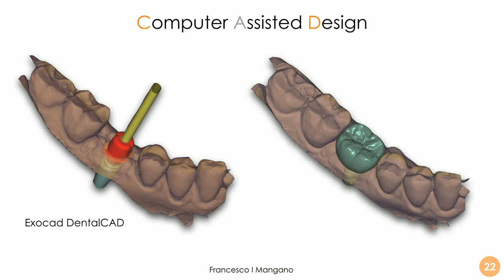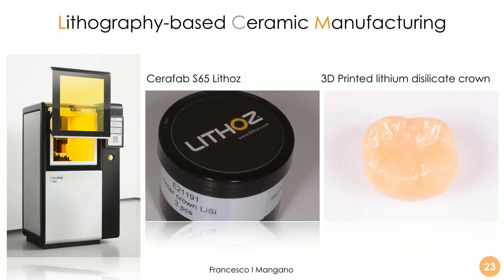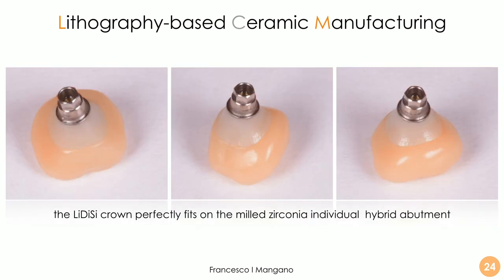The implant position was captured using scan bodies with the CS 3700 intraoral scanner. The dental technician then worked inside exocad software to plan the individual hybrid abutment and the crown. The crown was produced using the CeraFab S65 by Lithoz — specifically in lithium disilicate — as a monolithic 3D-printed crown using the lithography-based ceramic manufacturing process.